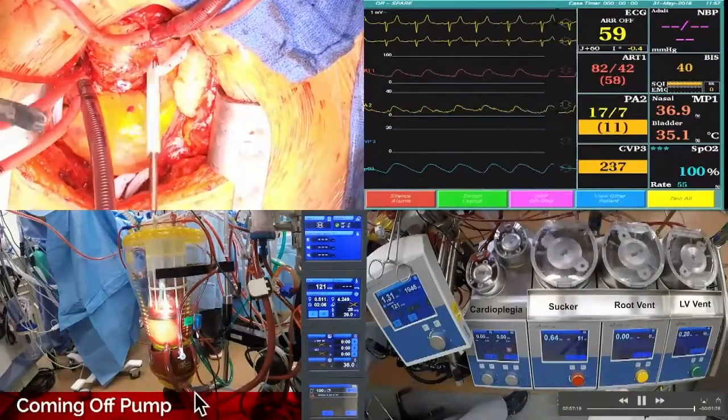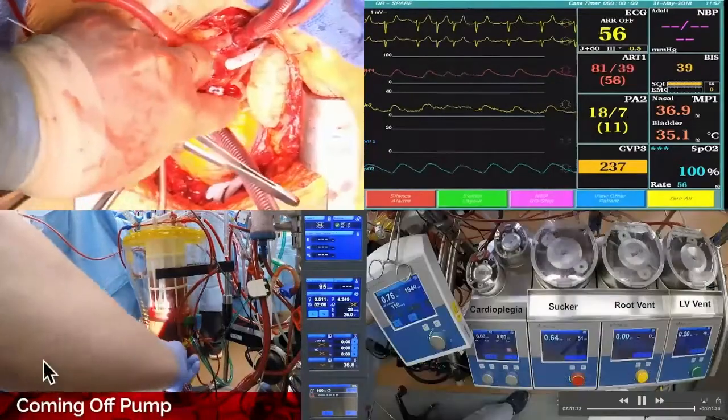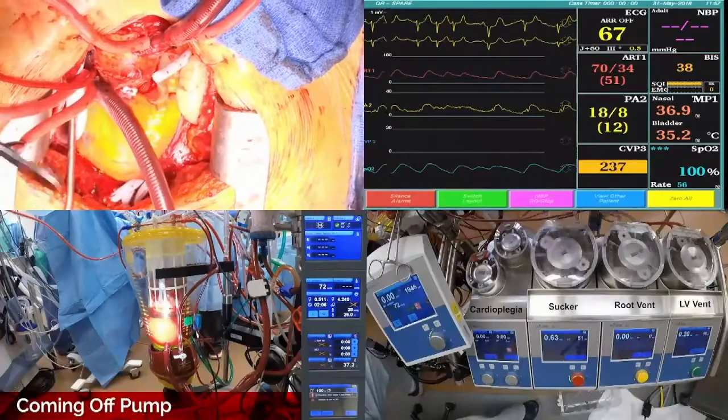Look, he's getting ready to clamp it. He's going to clamp it right here. There he goes. Boom. We go off. We go off fast. He is off. Well, especially after a 3 hour run. Yeah, watch it, Patrick.